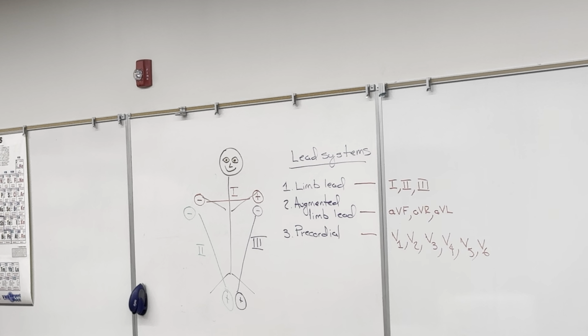So you'll be recording the PR interval, the QRS interval, the QT interval, the ST segment. You'll see it all in the lab. But make reference to this diagram in terms of each of these different waveforms, intervals that you're going to have to measure. Everybody with me on that one? Any confusion about that? All right.